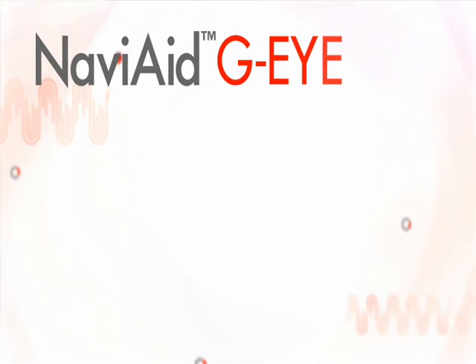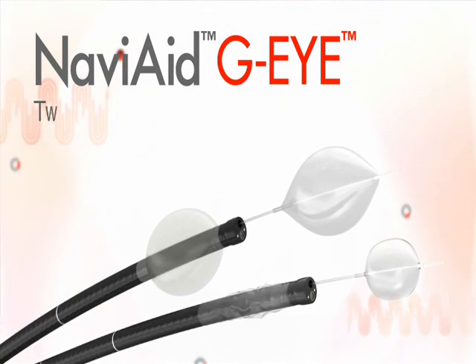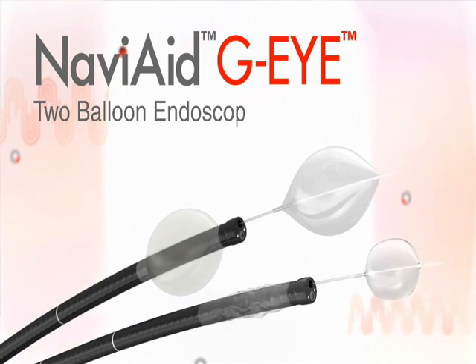The G-EYE Endoscope, supported by the SPARC-2, can readily function as a two-balloon endoscopy system when combined with one of the Navi-Aid single-use balloon devices.